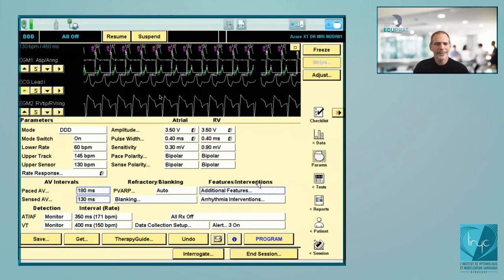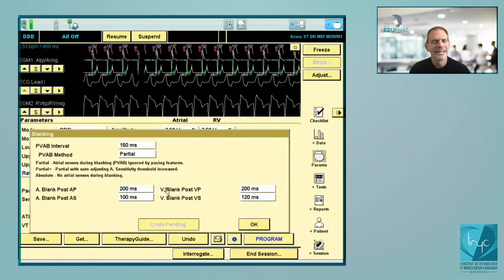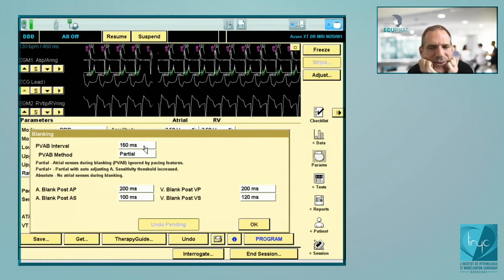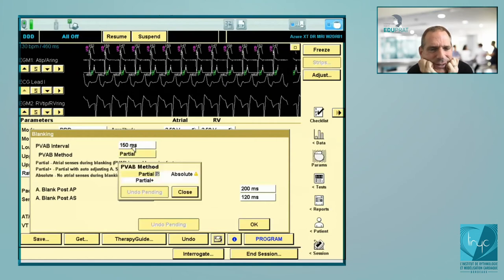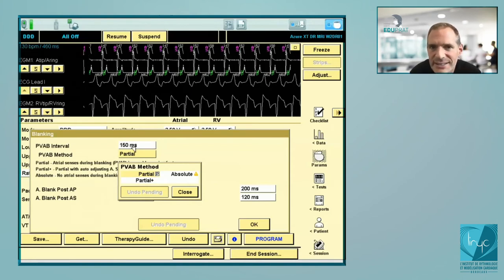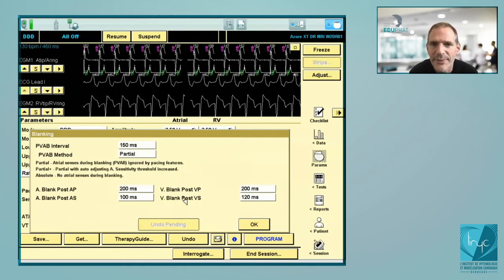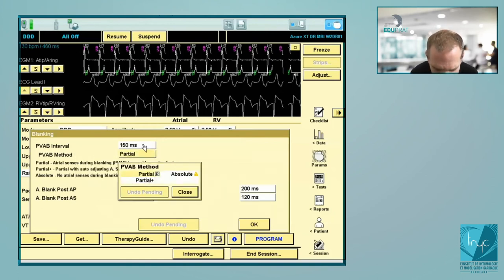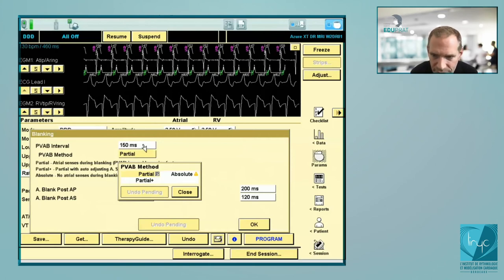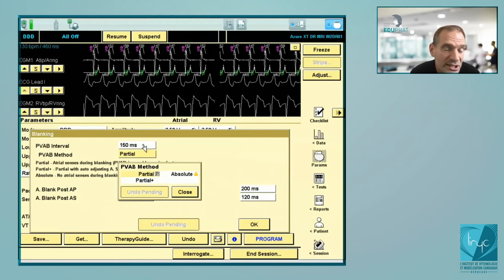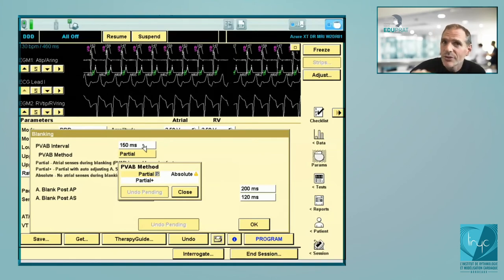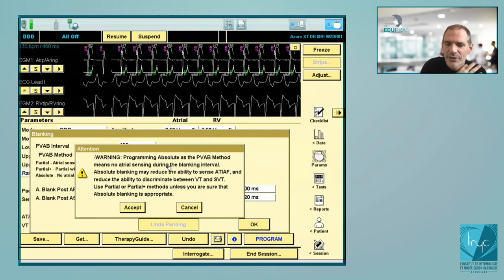If you click on blanking, we were discussing the PVAB — the blanking following ventricular pacing. You have the possibility to program the method. There are three possibilities. The first is absolute blanking: if a signal falls inside the absolute blanking, you will not see any marker and there's no interference with the atrial fibrillation counter. That's a good possibility — if you program absolute blanking, you avoid all the problems of false AF diagnosis.